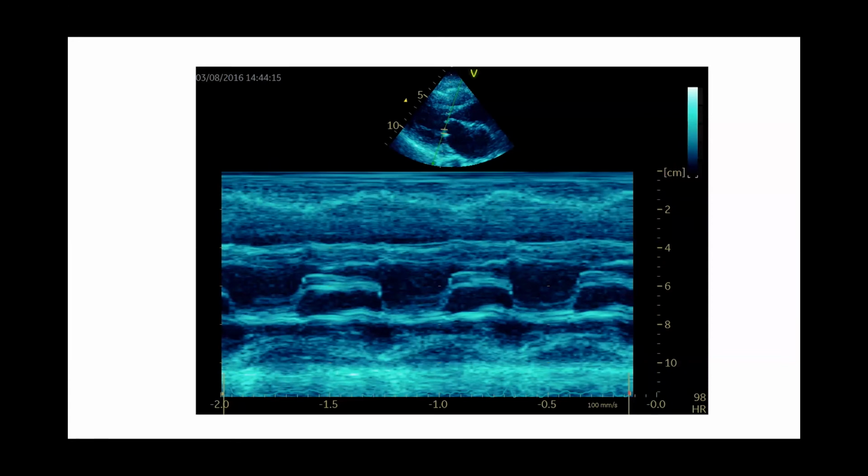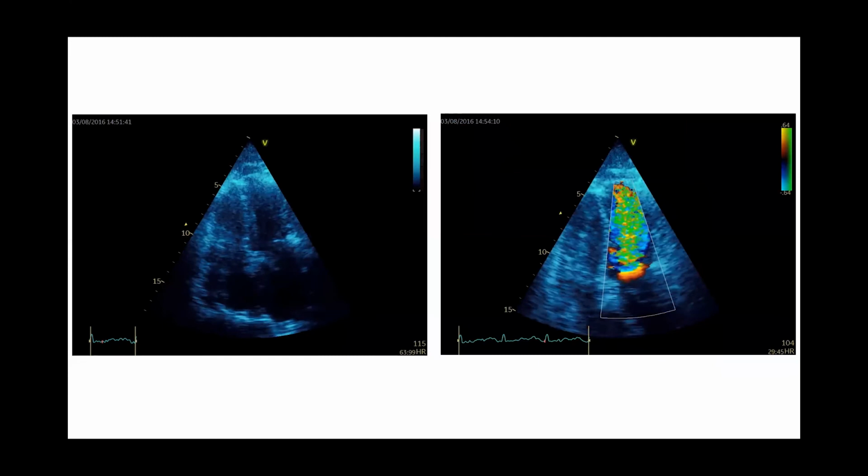Switch over to an M-mode view now with the M-mode cursor through the mitral. What I can see is what looks to be severely restricted opening of the mitral valve cusps. I'm struggling to see the ECG trace, that's lost in the bottom of the screen. Here it looks like she's in sinus rhythm. They look fairly regular. And it looks like there's severe reduction in the mitral valve opening. The septum appears to be thickened, was moving well.